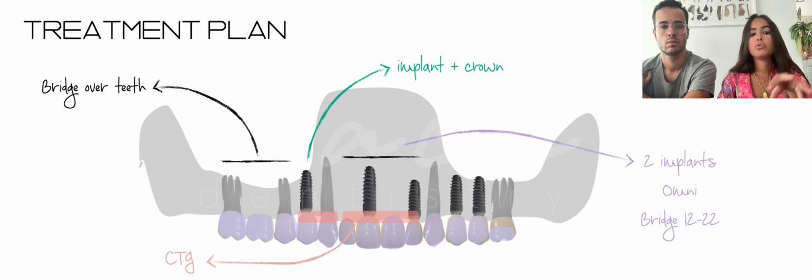Here our plan was to do an implant-supported restoration without a pink component, which means the restoration will directly emerge through the gums, simulating the natural dentition. And for this kind of case, it's very important to choose prosthetic components that most closely resemble the dimensions of the natural teeth.